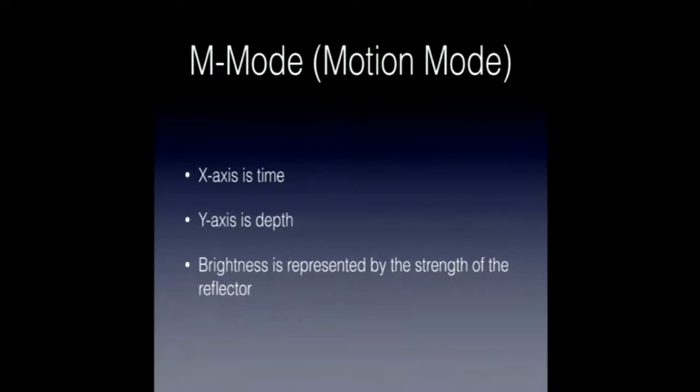So I'll switch around now. We've talked about grayscale imaging, we've talked about color flow Doppler briefly, and now I'll talk briefly about M-mode imaging because it's actually pretty cool. And it wasn't the first mode of imaging that I really tinkered around with a lot.